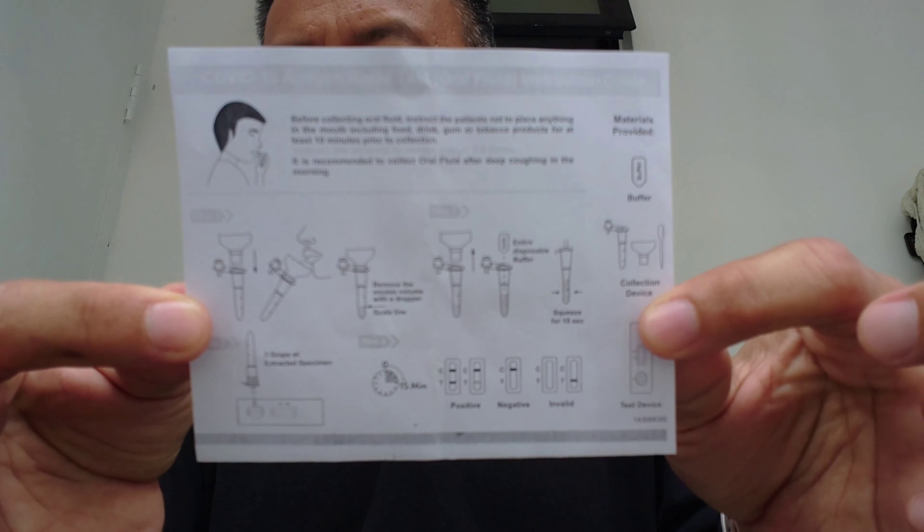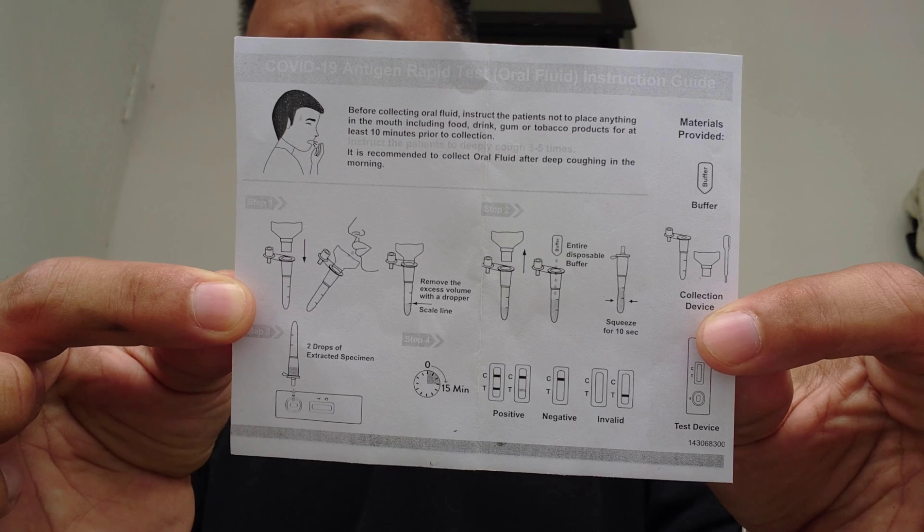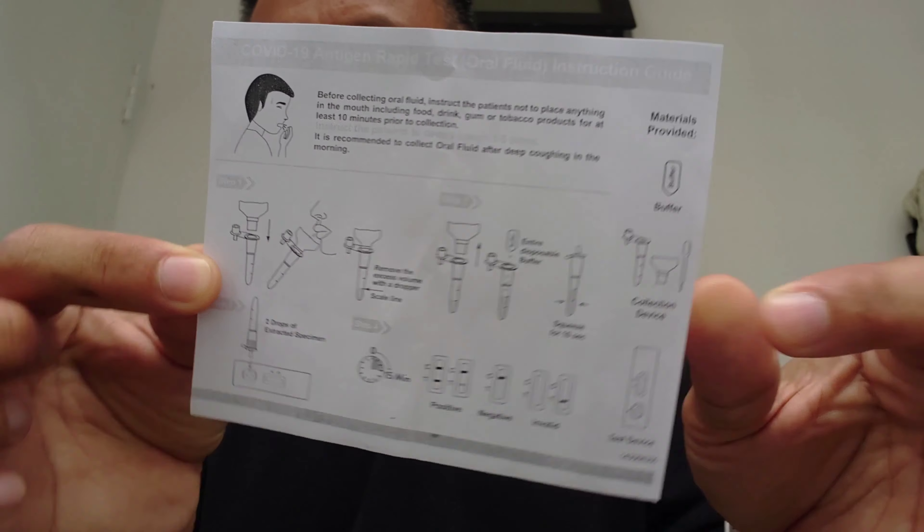Maybe you can pause so that you can read this later. Okay, firstly, before collecting oral fluid, instruct the patient not to place anything in the mouth — so that means for at least 10 minutes before the testing. Do not eat or drink anything.